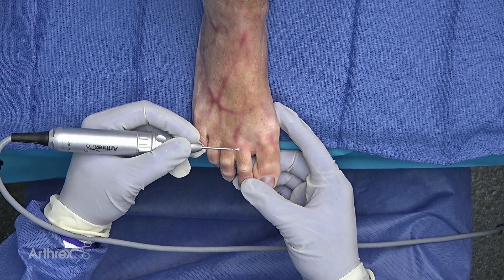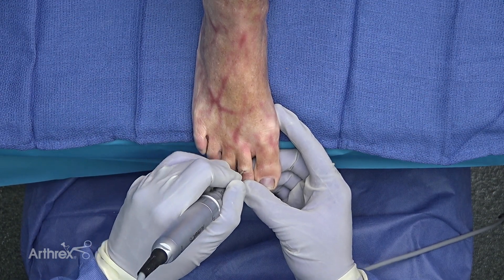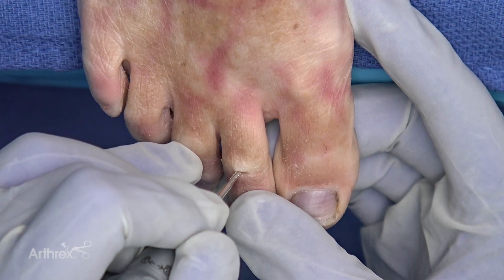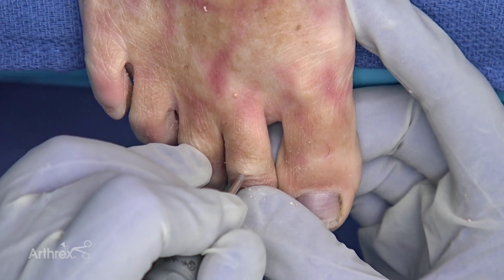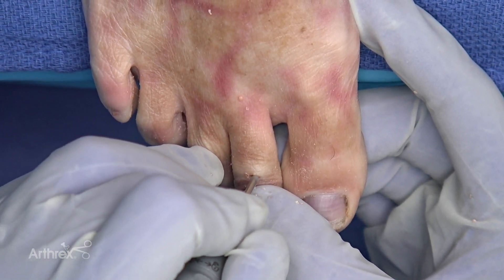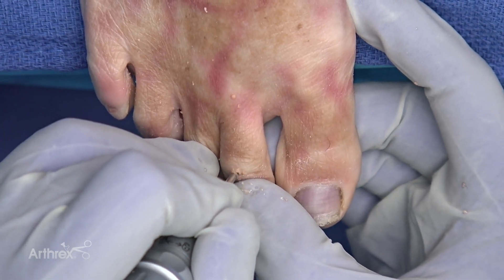First we use the 2 by 8 millimeter Shannon Burr. This is going to create a pocket in our joint to accept the larger 2.9 millimeter wedge burr. I can feel the burr going into the joint. You can do this under fluoroscopic guidance if you're not familiar with the feel.